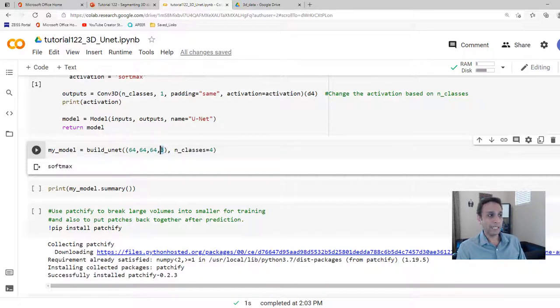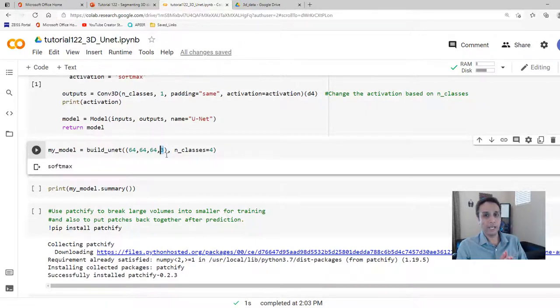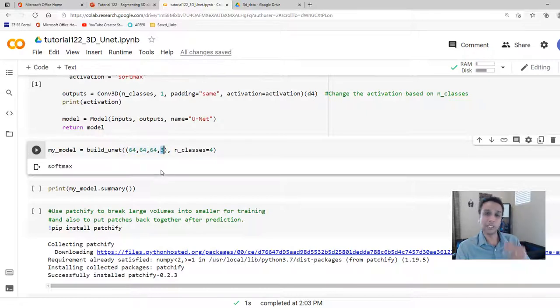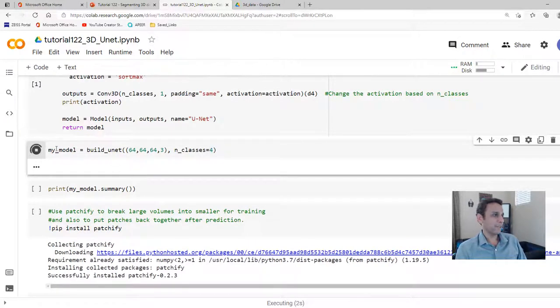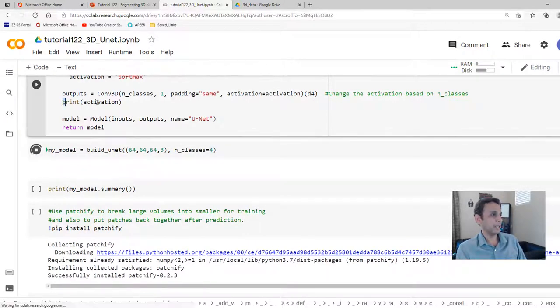For multi-channel images — for example the BraTS brain scan dataset — you can combine multiple channels into a single input. If you have four different modality channels, make the input 64×64×64×4. For now, let's keep it at 64×64×64×3 (X, Y, Z, and three channels) with number of classes equal to four. Let's print out the model summary.